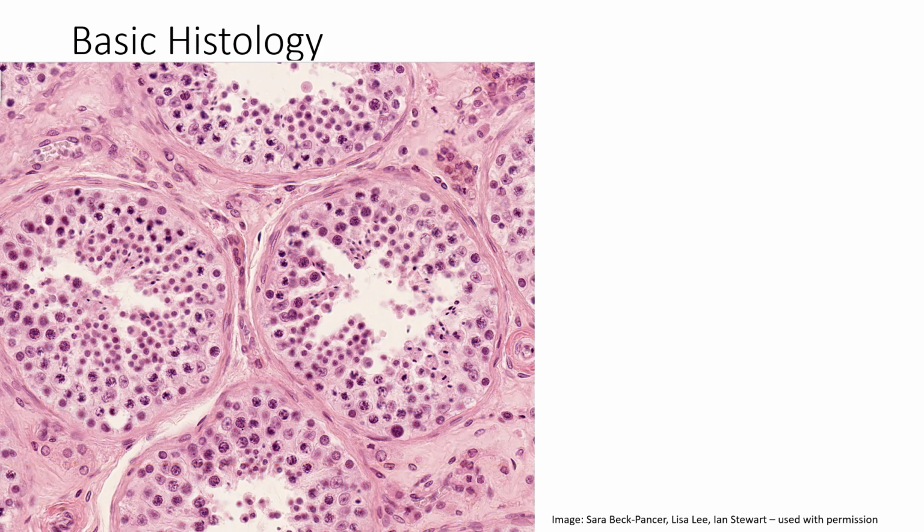As I mentioned previously, germ cell production, that is, in the case of men, sperm cell production, takes place inside these tightly coiled tubules called the seminiferous tubules. And as you know, if you cut a tube in cross-section, you get a circle. So as I go in here, I can draw a circle around a single seminiferous tubule. Very nice. You can see if you look closely that the seminiferous tubule is surrounded by a thin layer of regular connective tissue. And since this is regular connective tissue, you're going to see numerous fibroblasts.